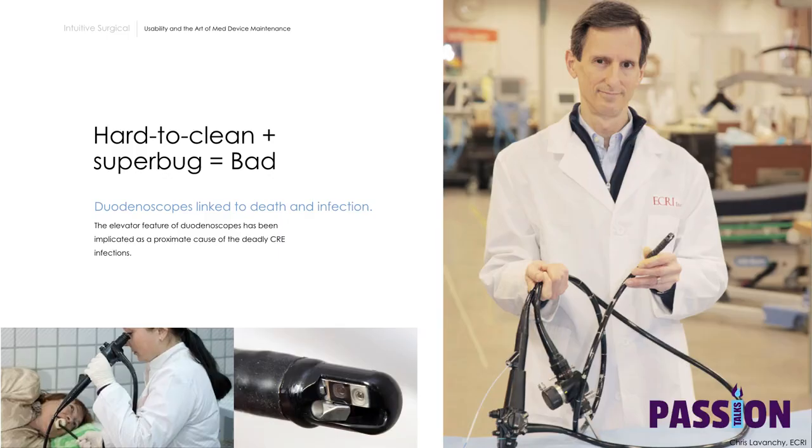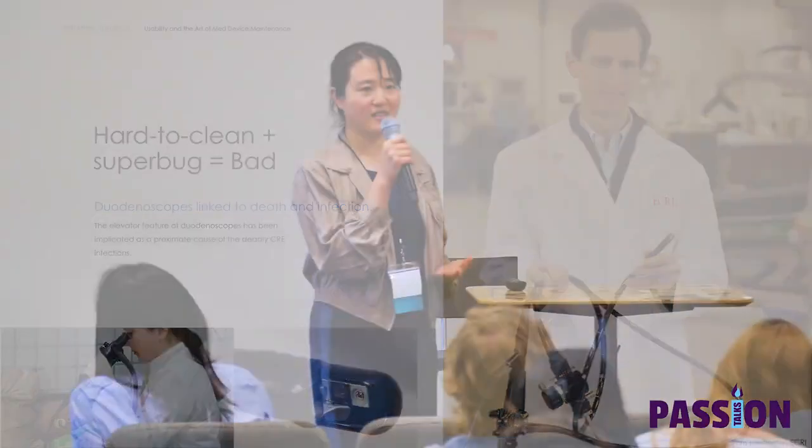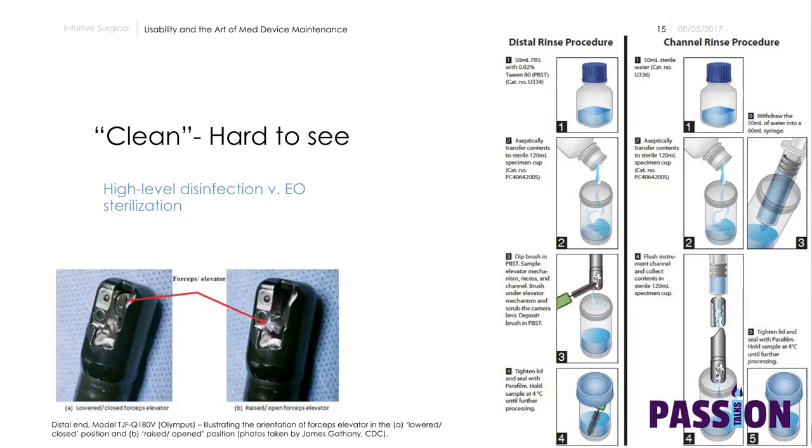But also, there's the ugly side. In this case, let's talk about the benefits of this product. This is a type of endoscope, a duodenoscope, which has a beautiful benefit: you don't have to cut open the patient in order to see parts of their small intestine and go in and take samples. So it goes in and they're able to do things like take samples and view it. But at the same time, you'll see there are many nooks and crannies, and there are a lot of steps involved with small brushes and other things. That's the other trade-off.